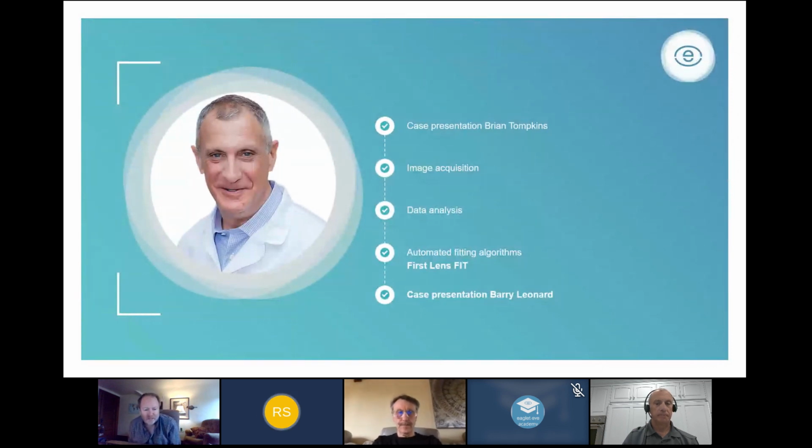Alex Gilman asks, will you choose? Sorry. There's a big issue trying to balance practitioner preference with the instrument itself making the recommendations. On top of all that, we've got to maintain our lab neutrality, so we don't want to get in an argument with any of the labs. Well, why did you pick this one over that one for that scenario?